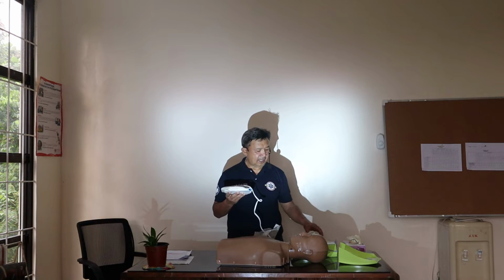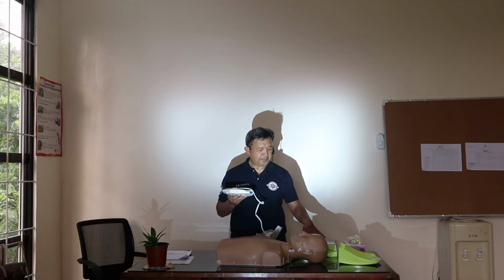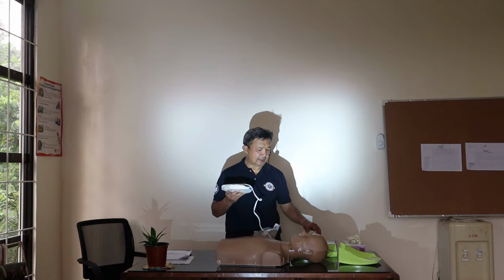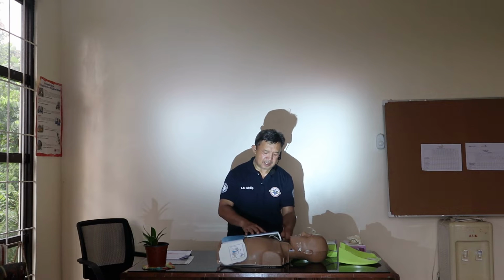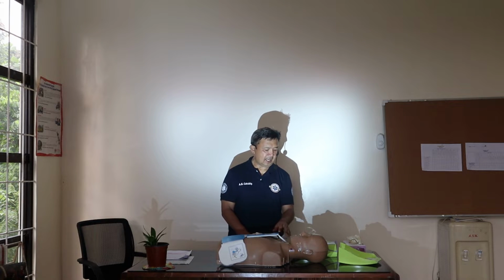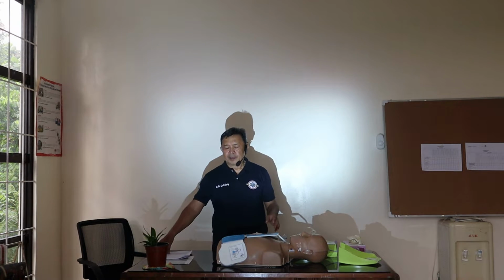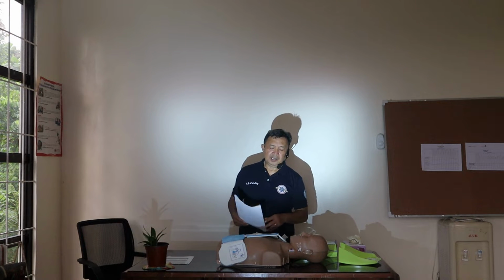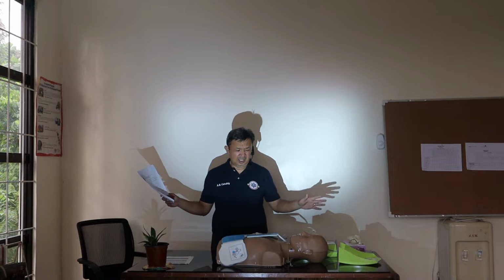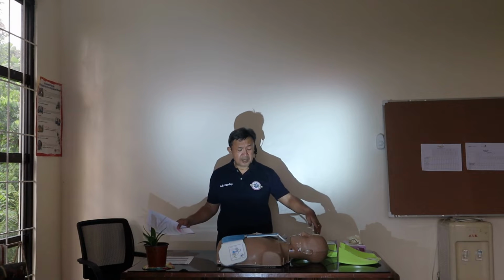After that, plug in. If the AED is not plugged in, you plug it in, then place the pads. So these are the pads. Once placed, the AED will give an audio prompt with instructions on what to do. The AED will say clear, so nobody touches the patient, then deliver the shock and push the button.